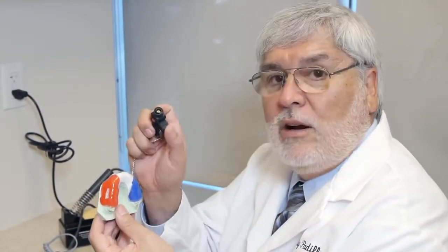Now we're ready for our final bite adjustment in the patient's mouth. So we'll get our torch and we'll gently heat the posterior. That's about all you need. You'll take the mouth guard off the model, place it directly in the patient's mouth, and have the patient bite until all the teeth are hitting evenly. It's important that the posterior teeth hit evenly. Then let it cool in the mouth, take it out.